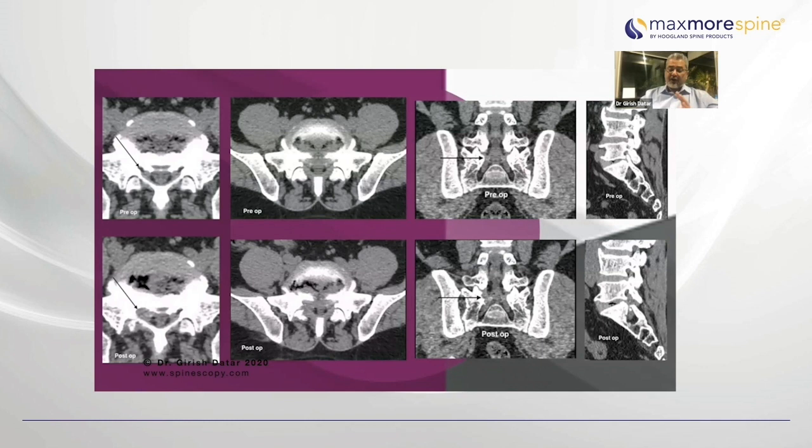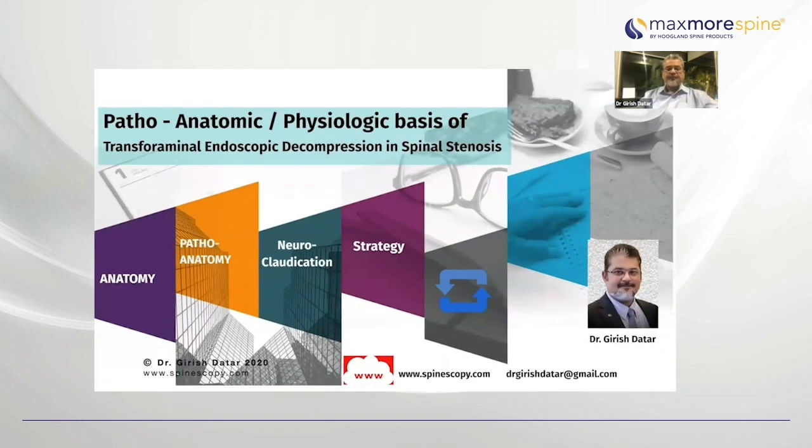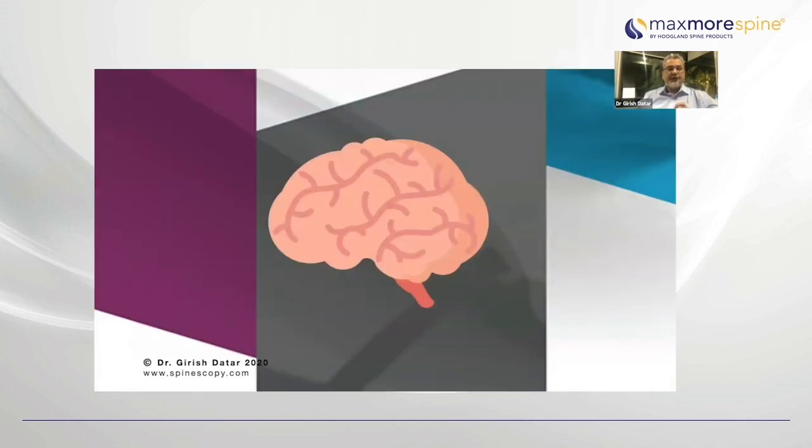So you are not only able to do an anterior posterior decompression, but you are also able to take off part of the medial wall of the pedicle, which makes it one of the kind of procedure where you are enlarging the whole lateral recess in both the planes. So it is going to be anterior, posterior, and medial and lateral. Sorry, not medial, lateral.